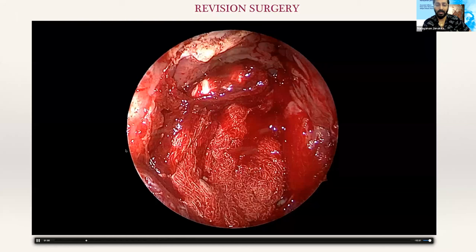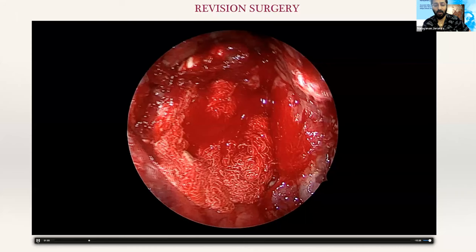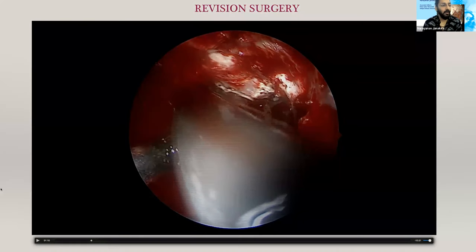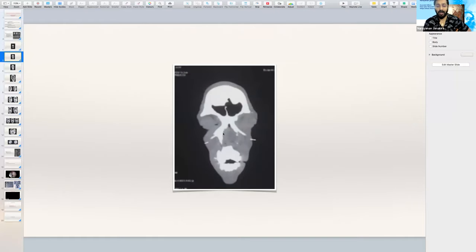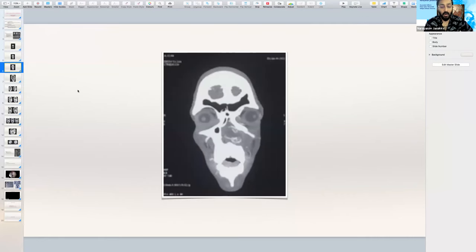Using my finger I took off a massive part of that non-enhancing JNA. Once I did that, the enhancing part could be visualized — that part can be removed endoscopically very easily. Now planning the next step with the scan: I've removed the anterior, less vascular part. Second, I have to go for the infratemporal fossa. I need to ligate the internal maxillary artery — but already the anatomy is so distorted because it's going into the maxillary sinus and cheek.